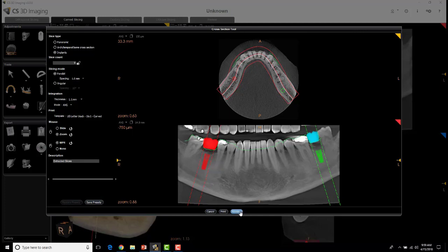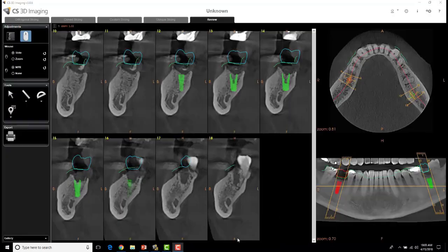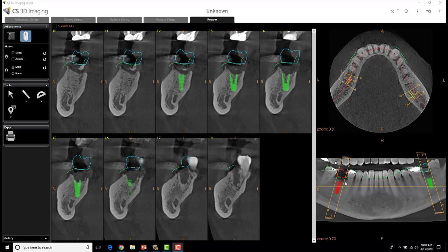At this point, all you have to do is select Review. You can see what this automatically generated for you — nine slices for this particular implant. I'll also show you how you can view the nine slices for the other implant. It automatically generates those slices per implant you've treatment planned.